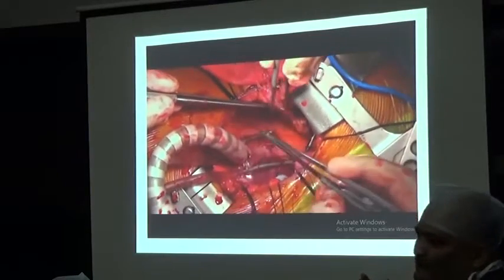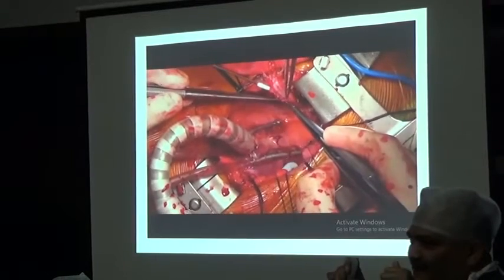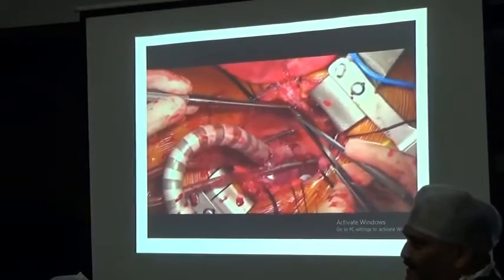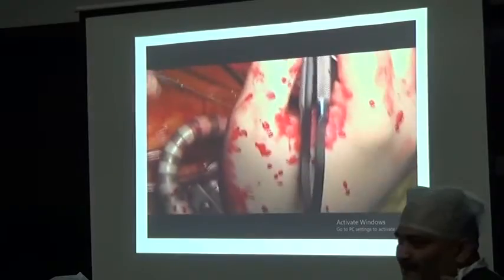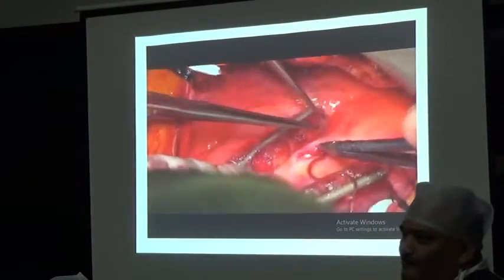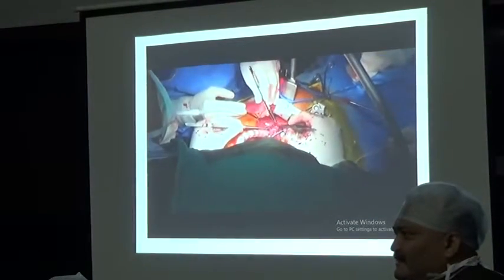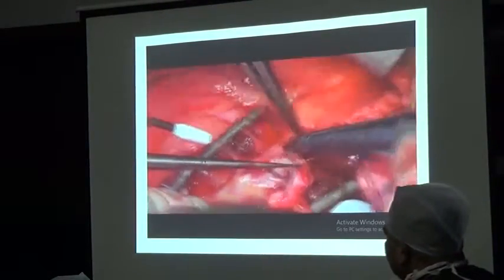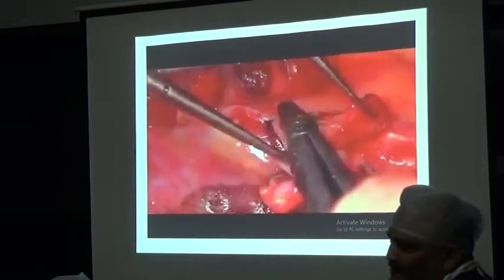The most common problem: suppose the patient fibrillates, because normally we have internal paddles. Here we don't have internal paddles. So either we have to use a pediatric paddle or there are external defibrillation patches available. If the patches are not there, you can't do this surgery. So we have applied, if you see the first slide in position, there are 2 patches over here, with which the defibrillator machine is attached. Whenever we require, we can give a shock. Those patches are disposable ones. The cost is almost 5,000 rupees for the patch.